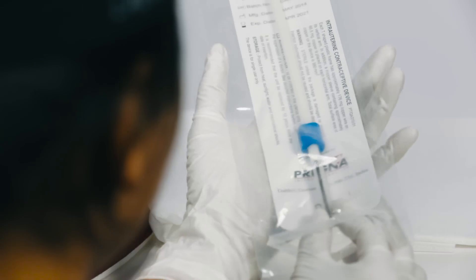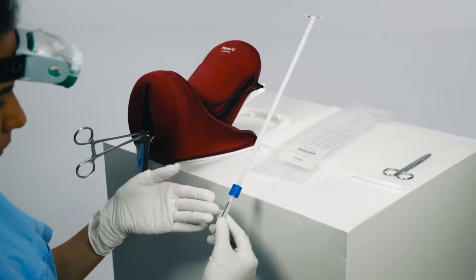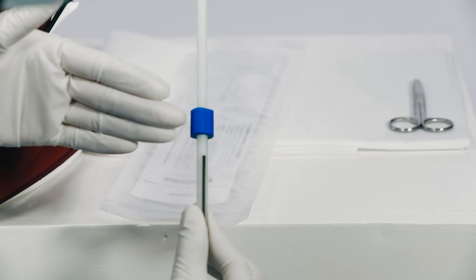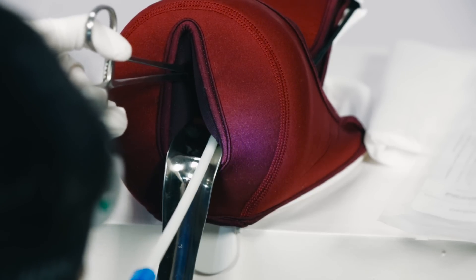Open the PP-IUD inserter. Make sure that the arms of the IUD are perpendicular to the blue flange and the black line. Insert the IUD through the cervix and into the lower uterine cavity.